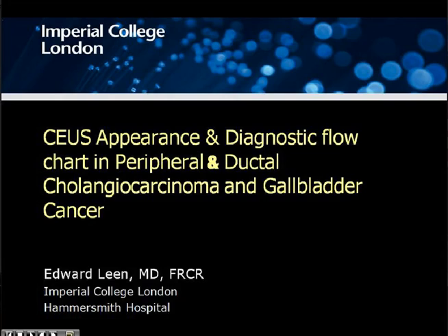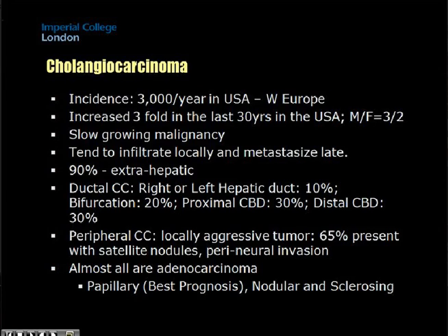As you've said in the title, this is really talking about the use of contrast agent in the workup for the diagnosis of cholangiocarcinoma and gallbladder lesion. First of all, I will deal with cholangiocarcinoma.